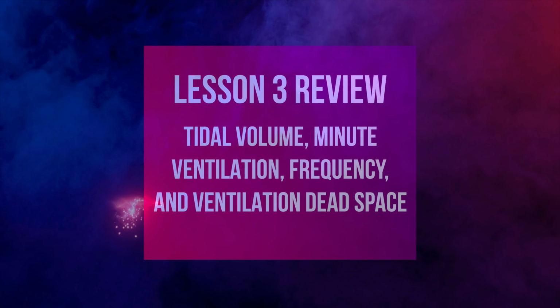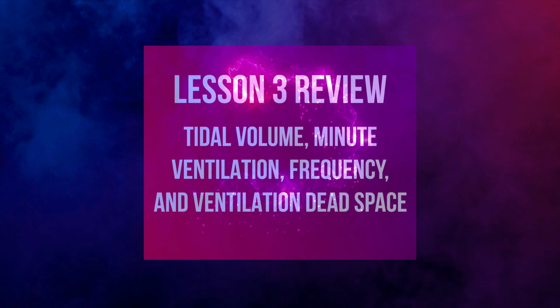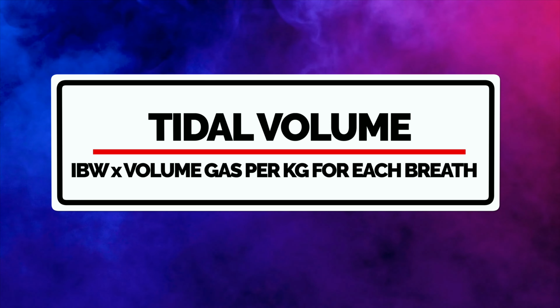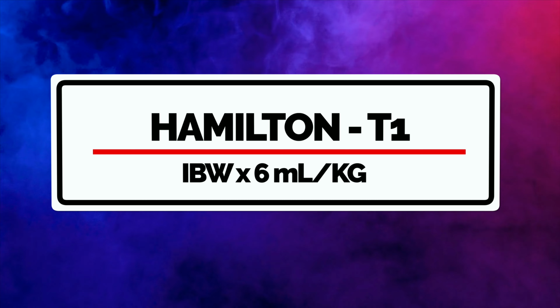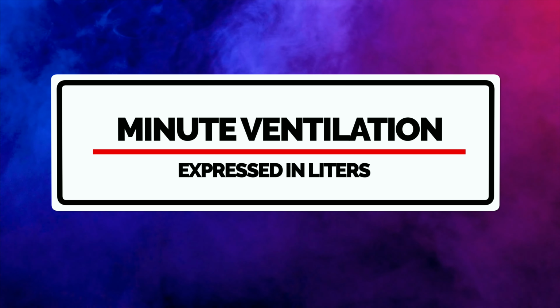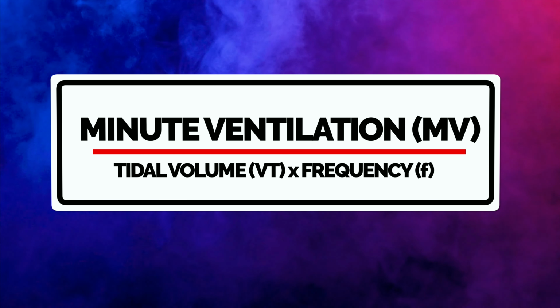Understanding the concepts of tidal volume, minute ventilation, frequency, and dead space ventilation is crucial for your professional practice in mechanical ventilation. Tidal volume, expressed in milliliters, is the volume of gas that moves in and out of the lungs with each breath. By default, the T1 calculates tidal volume by multiplying the ideal body weight by 6 milliliters per kilogram. Minute ventilation, often called minute volume, expressed in liters, equals tidal volume times the ventilation frequency, or breaths per minute.